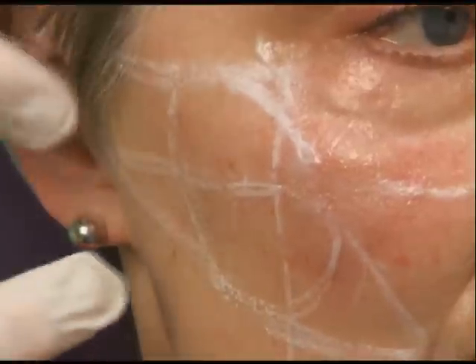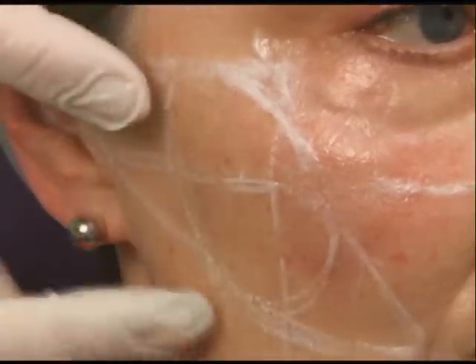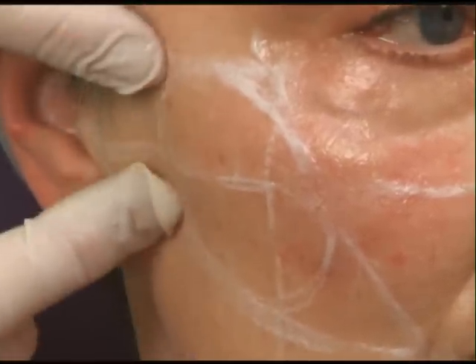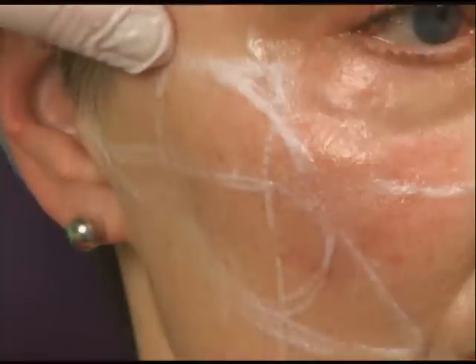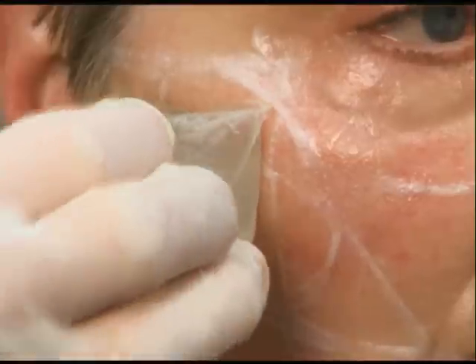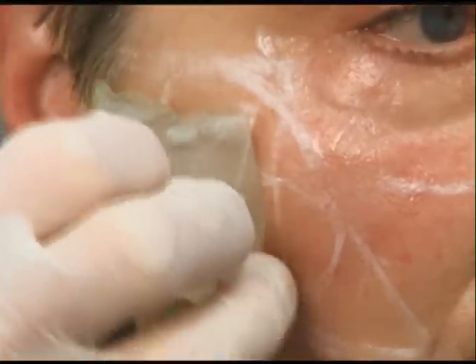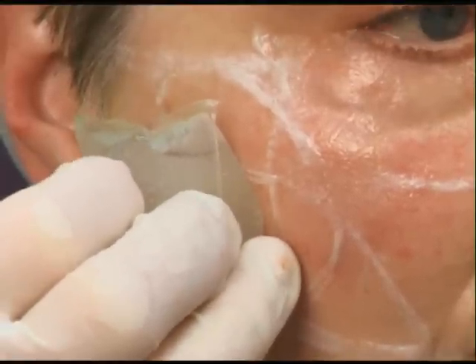What I want to do here is try to bring this out a little bit, because she really doesn't have much volume loss. But really what I want to do is lift this lower face — and that's a tough area. It drives people crazy and it's kind of a hard area to correct without surgery. But if someone could use a little bit of volume in their cheeks and even in the preauricular area and the back of their jawline, it's going to help pull all that skin up a little bit and suspend it so it doesn't look like they have extra skin.